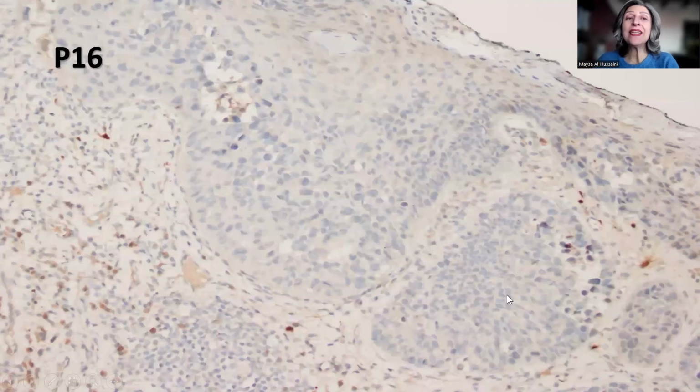What was also really interesting is P16 in this particular case, because we always have to assign an HPV association status to cervical as well as vulvar carcinoma, and we use the P16 immunohistochemistry as a surrogate marker for the HPV status. Remember that the usual staining pattern that is associated with HPV infection is the block positivity.